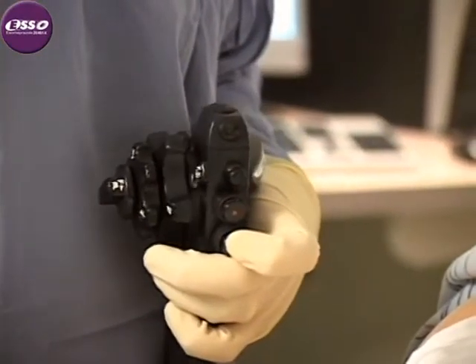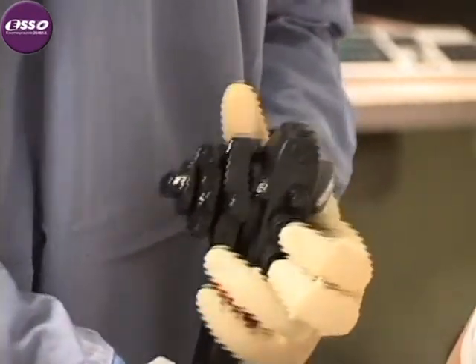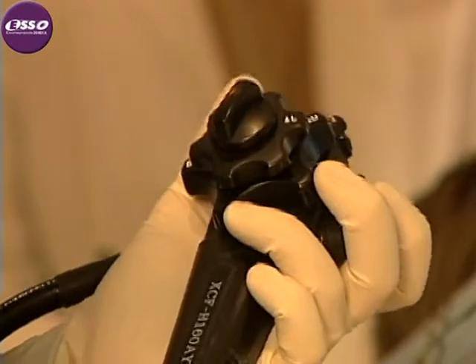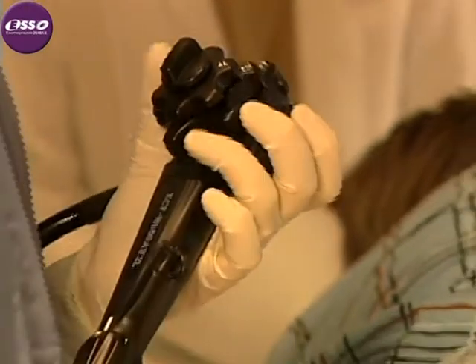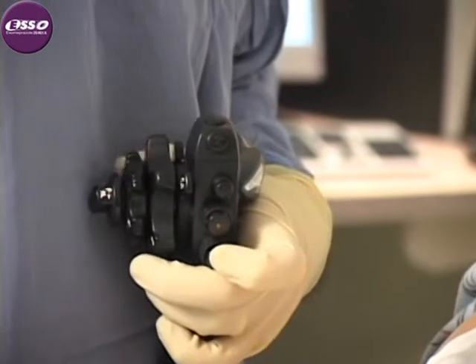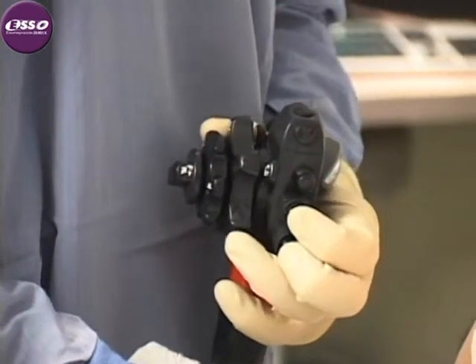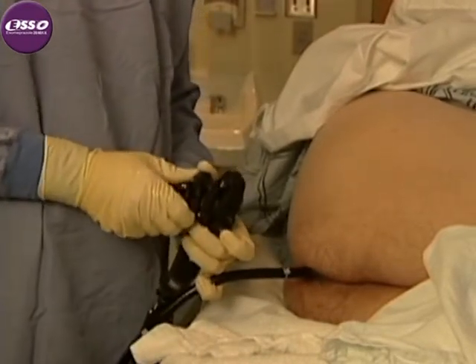The control knob that is easiest to access is the up-down control. The bending head can easily be deflected in the up direction by using the thumb, but it is most easily directed in the down deflection using a combination of the thumb and the fingers, which pull the control knob down. And I believe this is also the most ergonomically sound way to manipulate the up-down control. Many colonoscopists manipulate the right-left control with their thumb also. My opinion is that for many of us, manipulation of the right-left control with the thumb is not an ergonomically sound maneuver. I prefer to take my right hand off the instrument shaft to operate the right-left control.